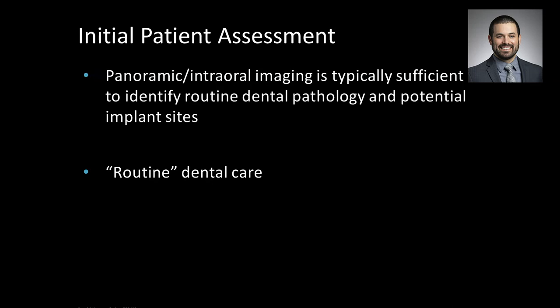At this time, and we discussed this a bit at the end of last week, cone beam CT is not a recommended frontline or initial indication imaging tool. It's too much from a dose and a time perspective.